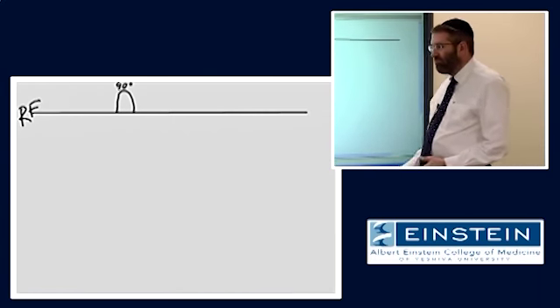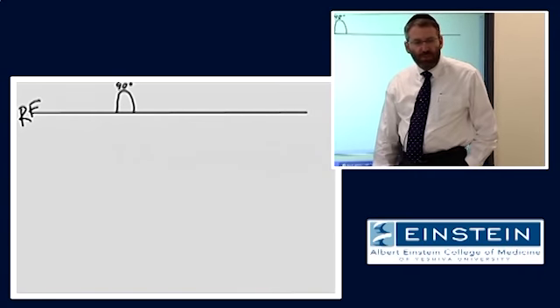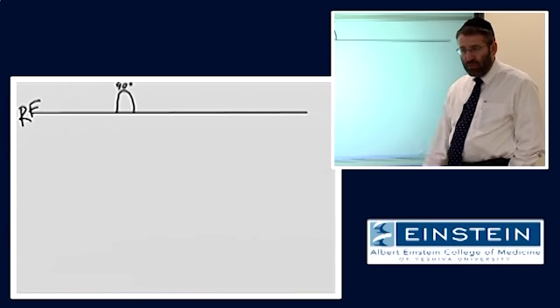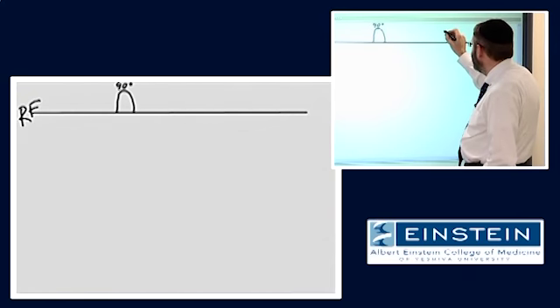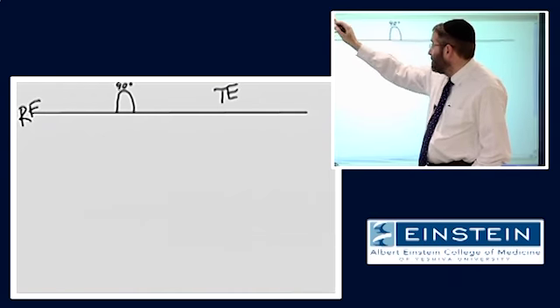But obviously, as we've already learned, it doesn't have to be 90 degrees. It might be some smaller amount of rotation of the transverse magnetization. And following this, at some point in time, which we called TE, we sampled the signal.